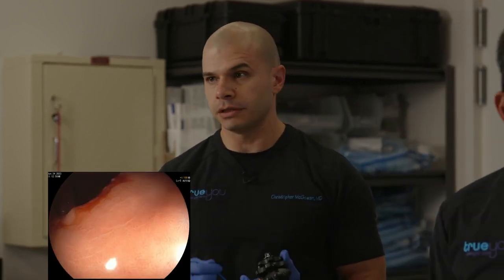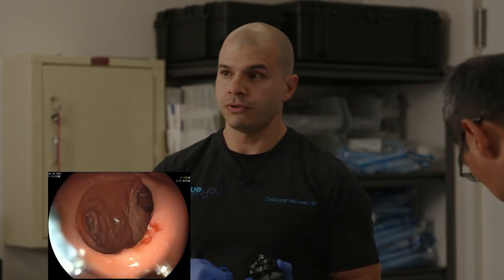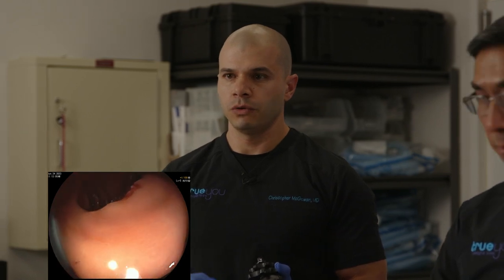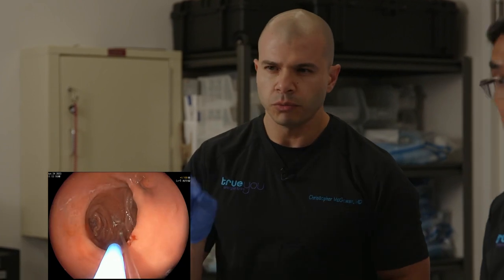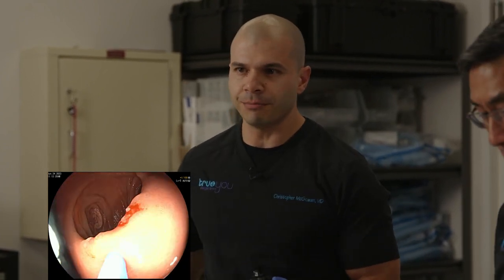Argon plasma coagulation is advanced technology where we're using a probe through the scope here, which will eject a stream of ionized argon, and then an electrical current will run through that, cauterizing the tissue. We look at it as basically a mini blowtorch, but it's much more advanced than that. But we're going to go ahead and do that.